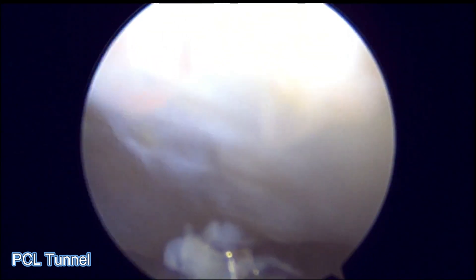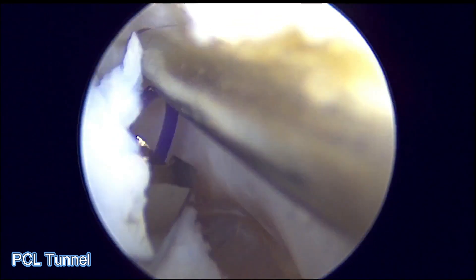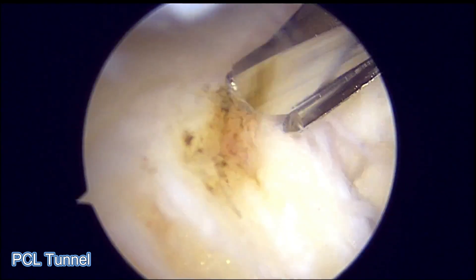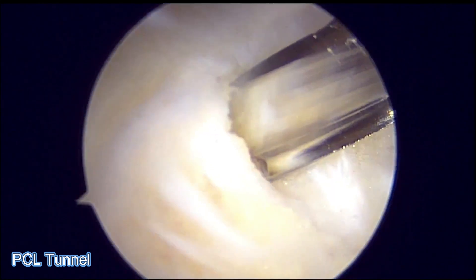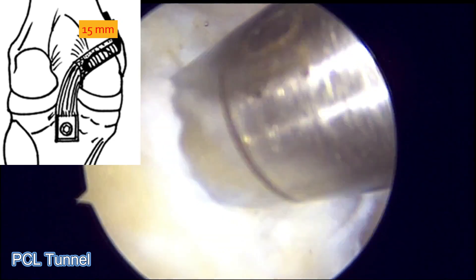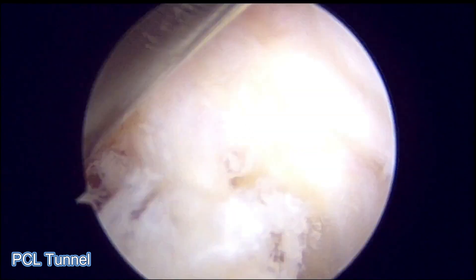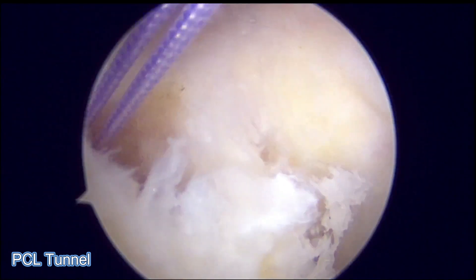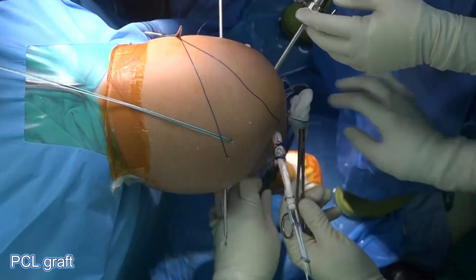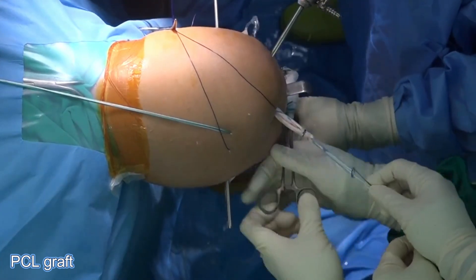The tibial tunnel for the PCL is created in a retrograde manner, adding 5mm for tensioning. The femoral tunnel is drilled to 15mm. The PCL graft is passed through the tibia slowly by rolling with a clamp to avoid graft pooling.